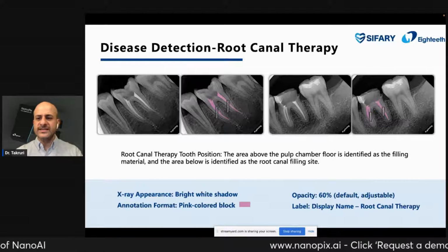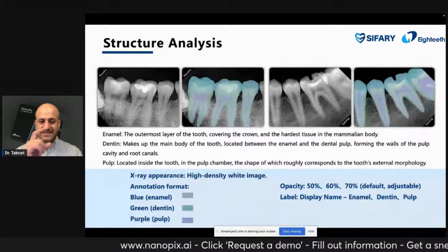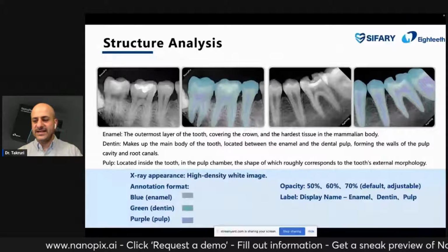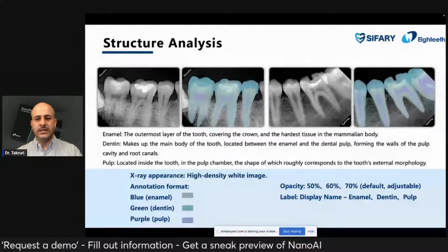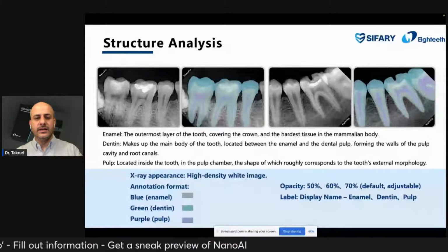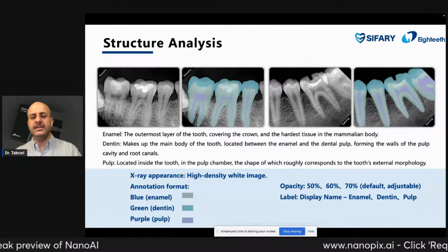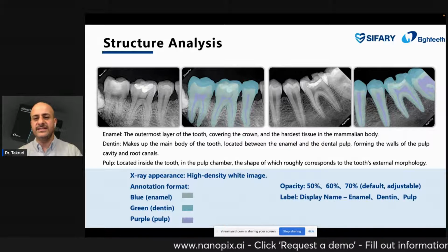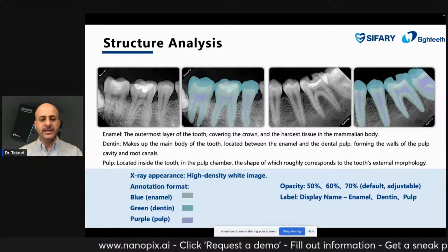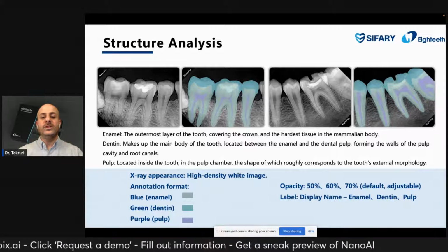Here is the same. When you are putting the filters, as I told you at the beginning, it's not only a filter. It's a machine analyzing. The machine here is reading, the machine is analyzing, the machine will learn, and the machine will be more and more experienced with time.